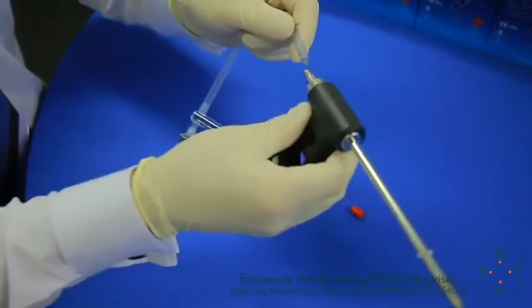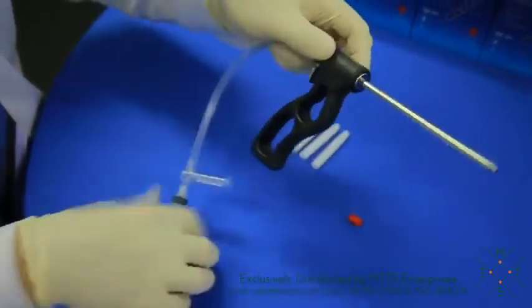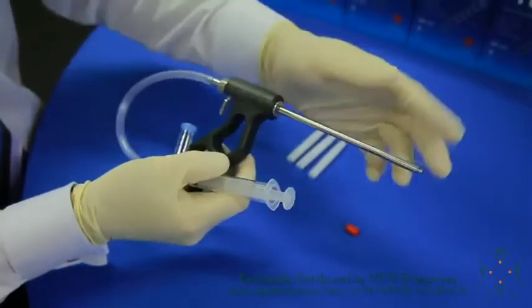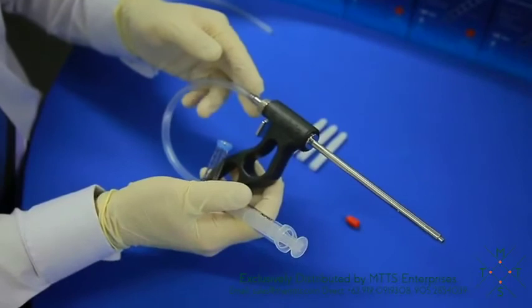We will then place the tubing onto the handpiece. Now it's very important at this stage that we don't load a capsule before we place the tubing onto the handpiece.